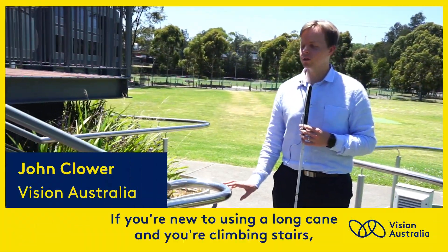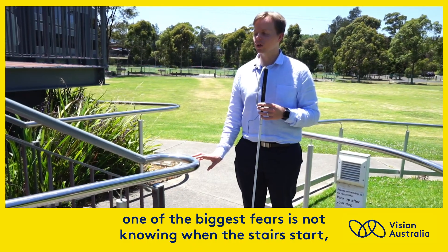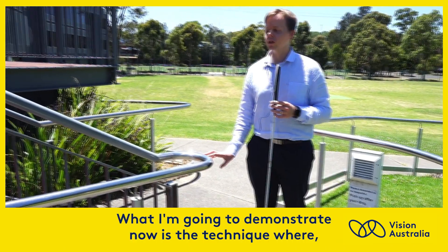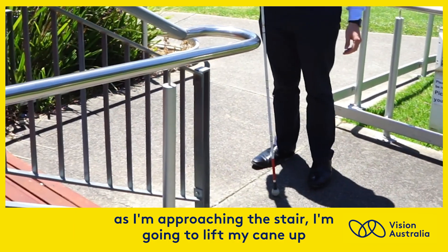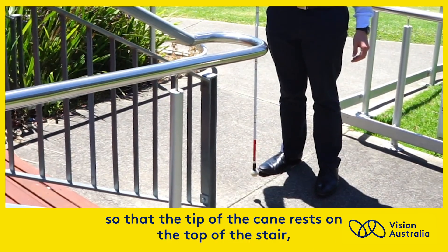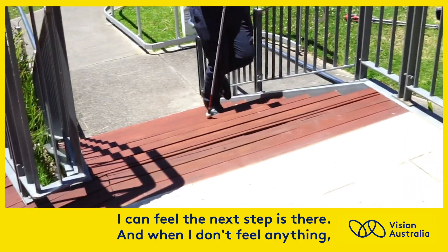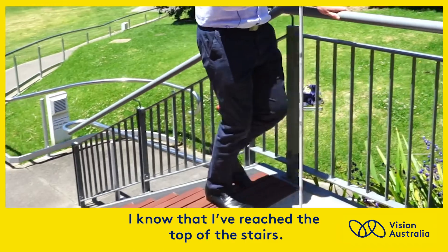If you're new to using a long cane and you're climbing stairs, one of the biggest fears is not knowing when the stairs start, not knowing when the stairs stop. What I'm going to demonstrate now is a technique where, as I'm approaching the stair, I'm going to lift my cane up so that the tip of the cane rests on the top of the stair, one stair in front of me, so that as I'm walking up the stairs, I can feel the next step is there. And when I don't feel anything, I know that I've reached the top of the stairs.